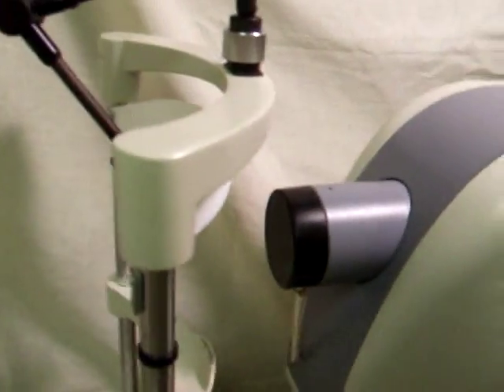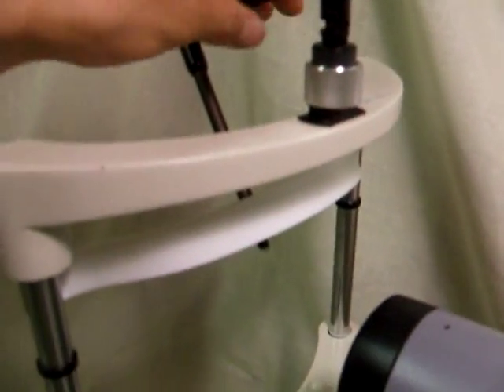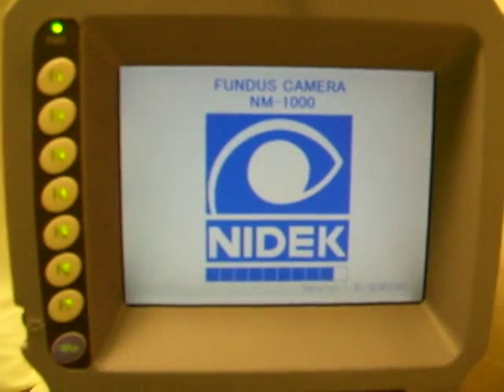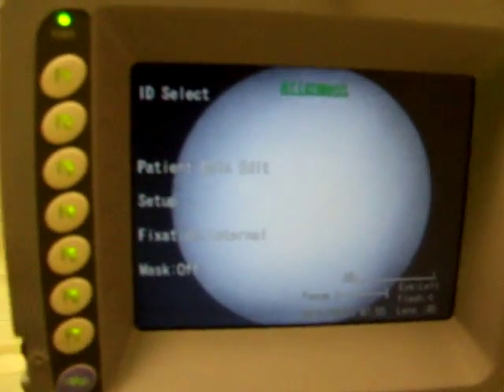I'll turn it on for a moment and then I'll show you the details of the outside. The external fixation is working fine. The lens cover is still on — I'll take it off. It works fine. You can see the internal fixation there. You can move it around with the joystick. And the external fixation also works.